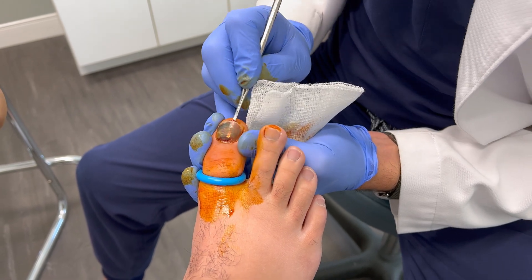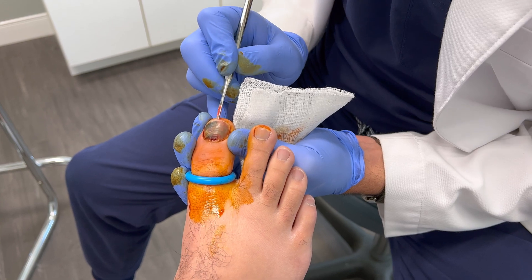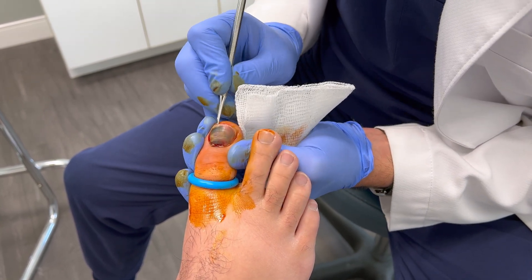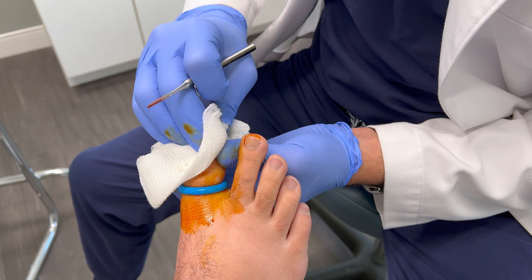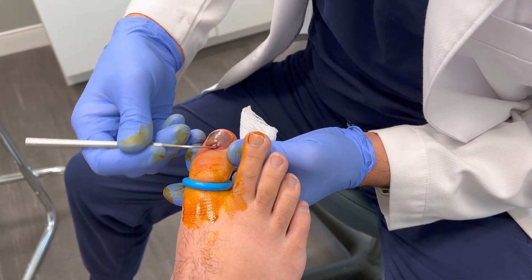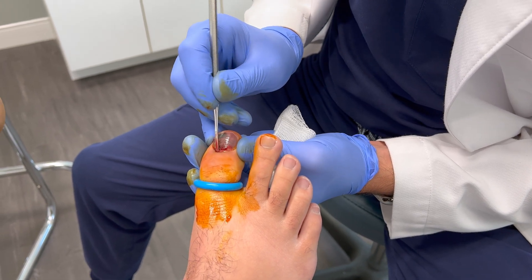This instrument is an elevator. It's being used to free up the underside of the toenail where it attaches to the nail bed, or the skin underneath the toenail. This procedure is performed utilizing local anesthetic, so the toe is numbed up before the procedure is commenced. This procedure should be completely pain-free.